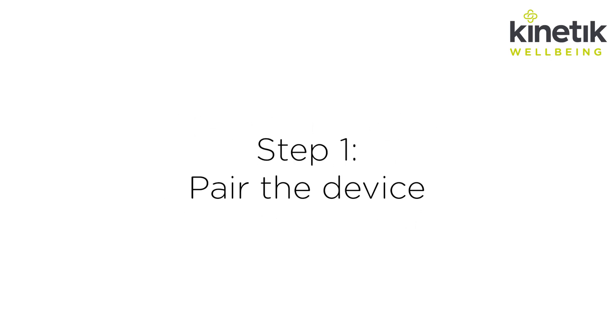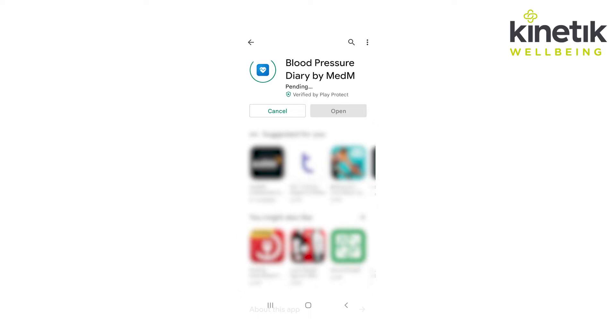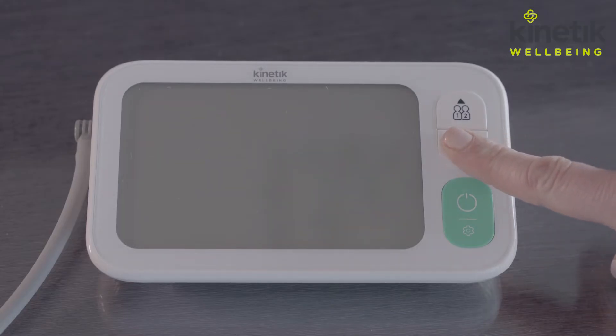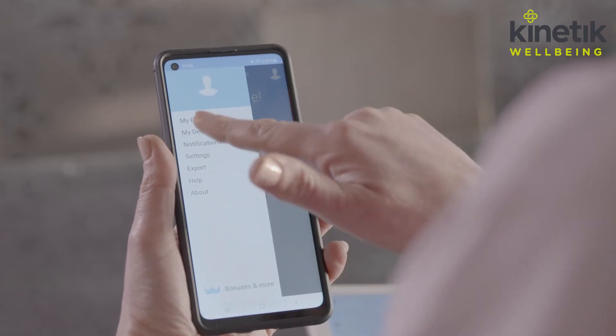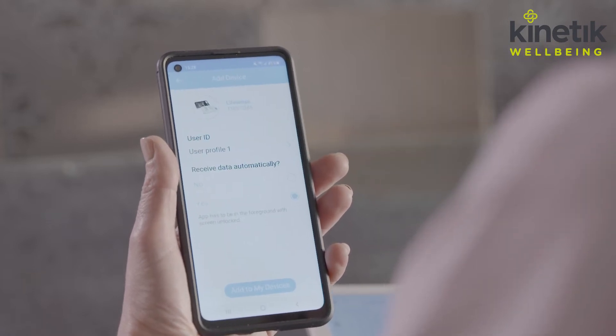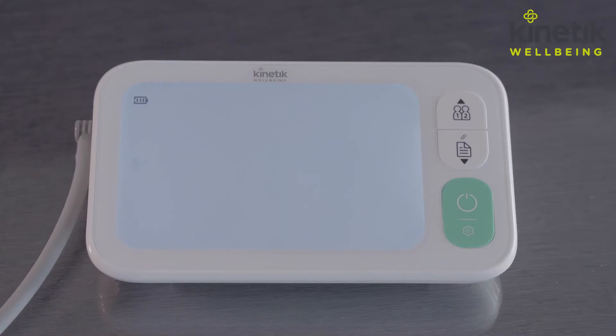Step one: pair the device. Before using, you can pair this device to your Android or Apple smartphone. To do so, simply download the MedM Blood Pressure Diary or MedM Health app. You can then register your details on the app or continue without registration. Ensure that Bluetooth has been enabled on your smartphone and the blood pressure monitor is close by. When the blood pressure monitor is off, press and hold the pairing button until the Bluetooth symbol flashes. In the app, select the drop-down menu and My Devices, then press Add New. Your smartphone will begin scanning for a new device. When detected, select the TMB2088. If successful, the Bluetooth symbol will stop flashing and the monitor will display 'Done'.